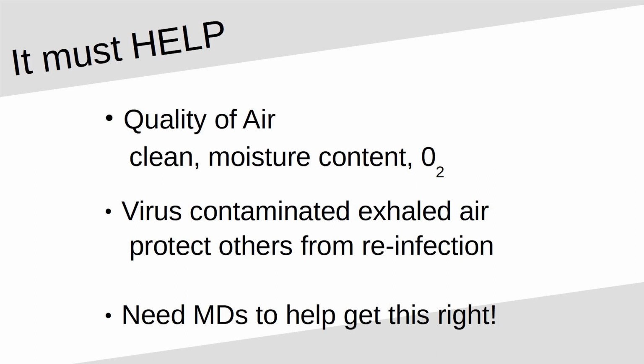One thing we've been looking at, for instance, is things like germicidal lamps to hopefully do away with some of the virus particles. We have no idea if that is the right way to do it at this point. So that's really the It Must Help section, and that's really why you need people like medical doctors involved.